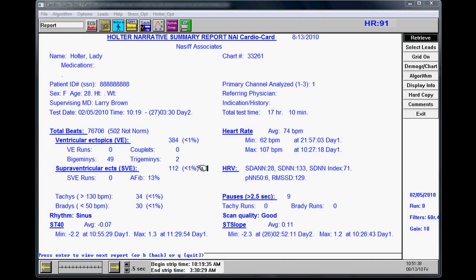You can view the supraventricular ectopics, the number of VE runs, the percentage of atrial fib, and you can view your tachys and bradys.